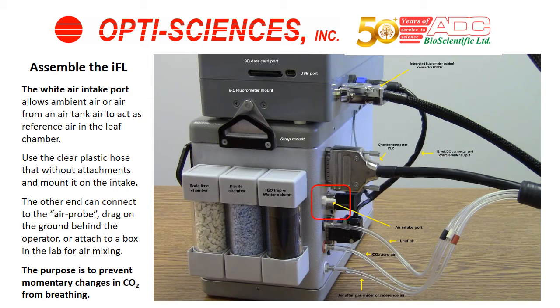The white air intake port, surrounded by the red box in the center of the screen, allows you to either use ambient air or a tank of air with the mixture that you prefer. If you're using ambient air, the plastic tube may be hooked to the air probe that comes with the system — a long plastic tube with a stake on the bottom. This allows air to come from an area not near your mouth, preventing a momentary change in CO2 level which can cause errors in your measurement.